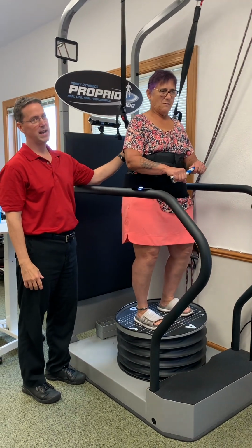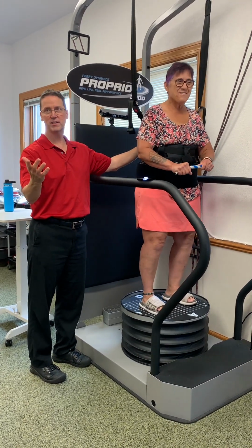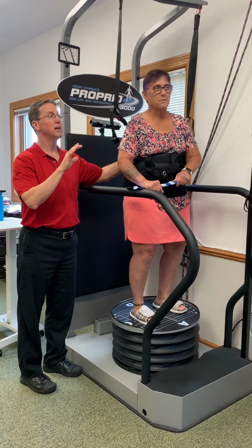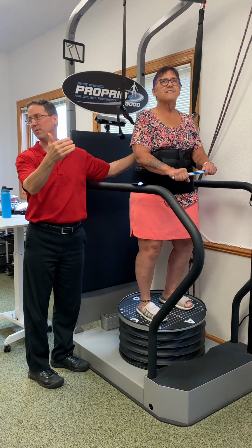I think we know what's going to happen if she were to close her eyes, right? Let me try it. Whoa! Yeah, perfect. All right, you can open your eyes. I have them open. I didn't catch my balance. Right. So that's a shock to the nervous system, right? That's a stress. A little bit much.